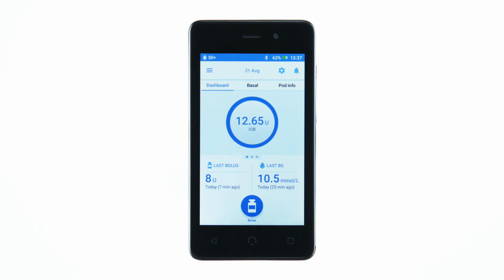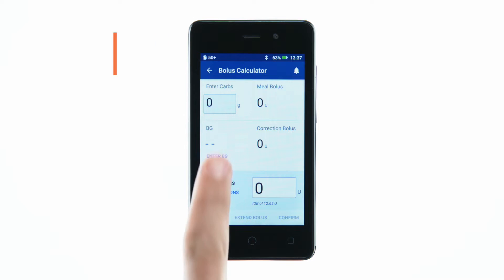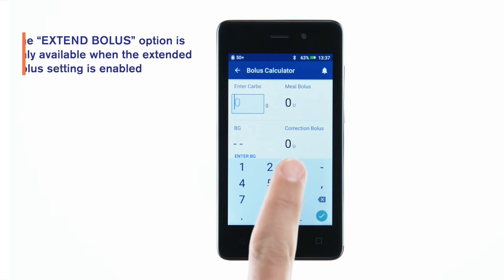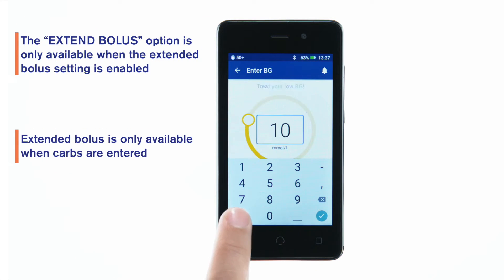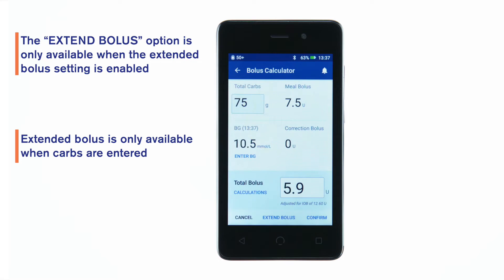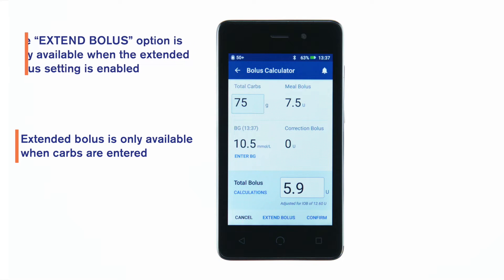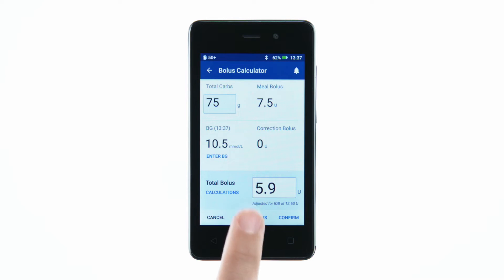To begin, tap the bolus button and enter the information as you would for an immediate bolus. Once you've entered the values and reviewed the bolus calculation, tap the Extend Bolus button rather than Confirm.